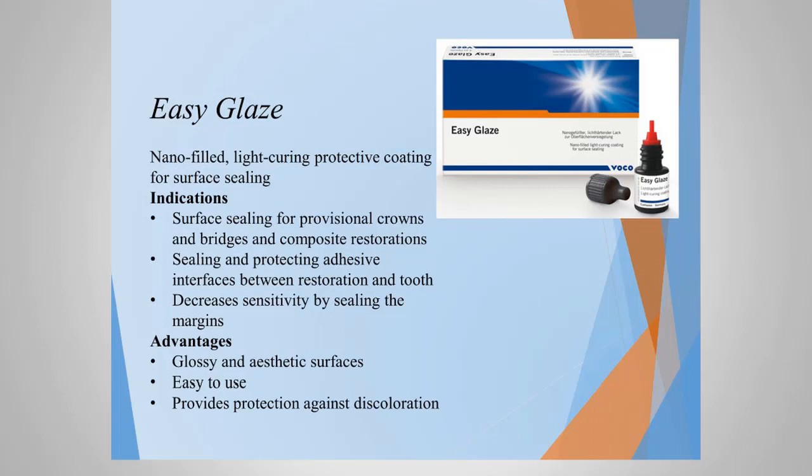It doesn't take much to work with this material. You can apply it with a micro brush or any kind of brush. It just goes right onto the surface of your temporary. Then you air thin it and then light cure it.